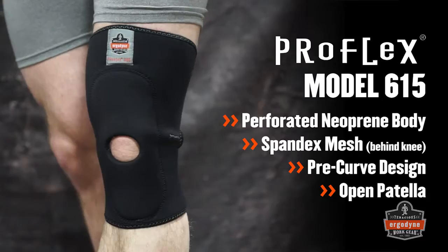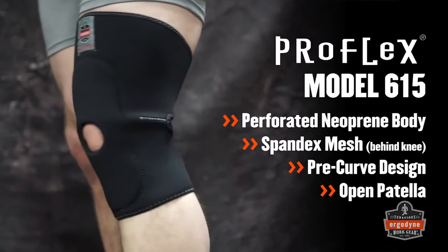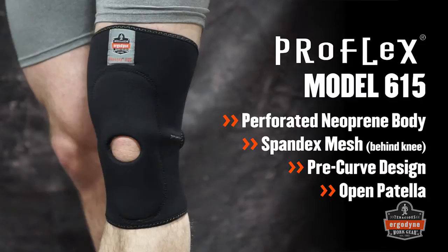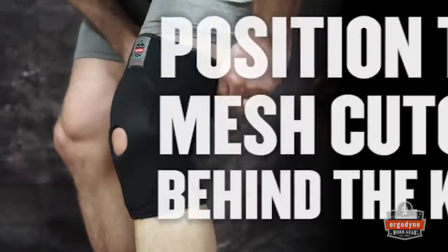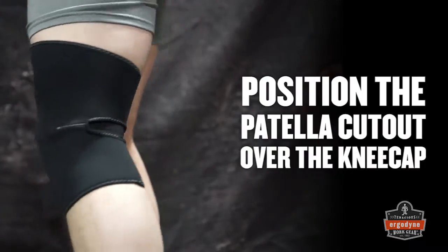The ProFlex 615 perforated neoprene knee sleeve also comes in a pre-curve design and features an open patella and added neoprene layer for cushioning and support. Pull up on the knee sleeve, positioning the spandex mesh behind the knee and patella cutout over the knee cap.